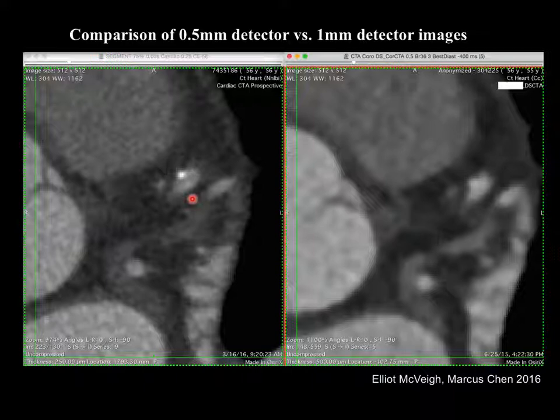It just flew off the shelves. They couldn't build them fast enough. But now, this kind of changes the whole calculus. Like, should we go to the expense? It's a big expense, right? You have a new detector, you have a lot more data processing and stuff like that.